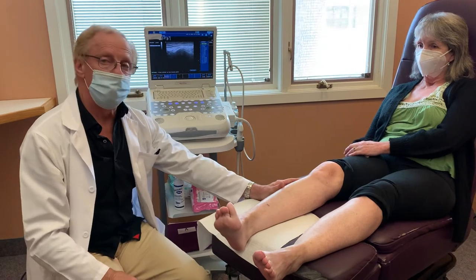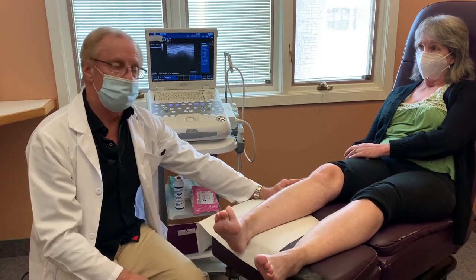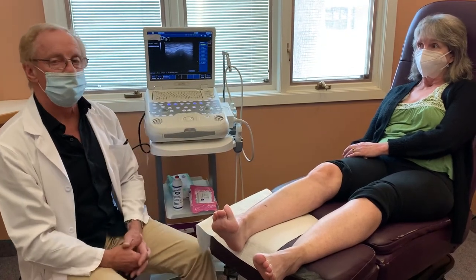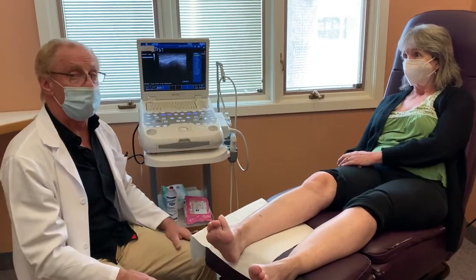What we're doing is opening that tunnel. This is a pretty serious case of drop foot, so is it going to make her 100% better? Probably not, but even if it's 50%, 40%, or 20%, people are just amazed and very happy with that. It might make the difference between them having to use a cane or a walker or whatever.